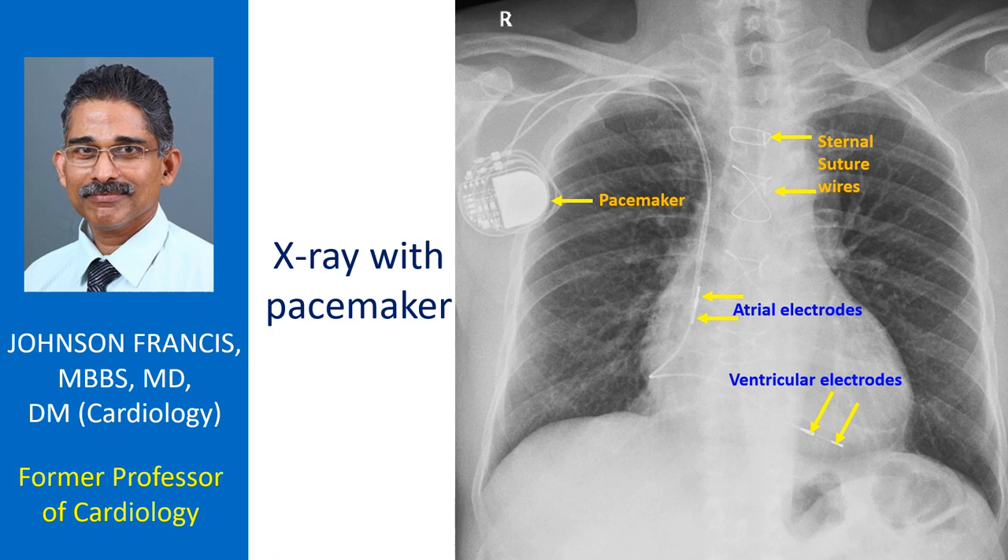Two leads originating from the pulse generator are tracking through the subclavian vein and superior vena cava. The atrial lead curves upwards into the right atrial appendage, while the ventricular lead reaches the right ventricular apex.